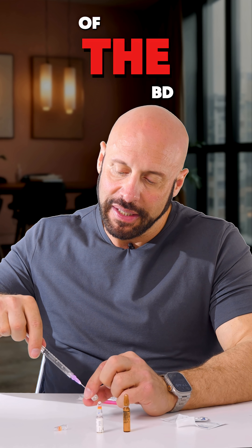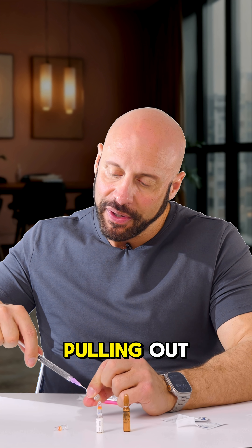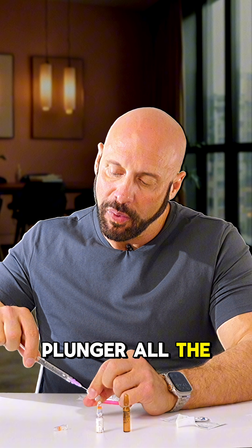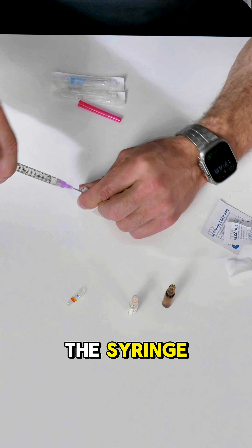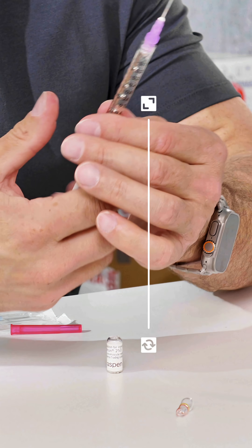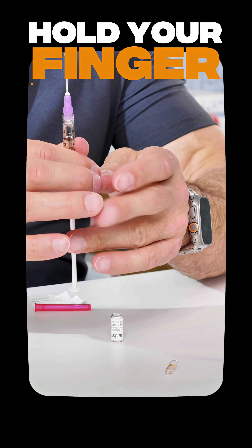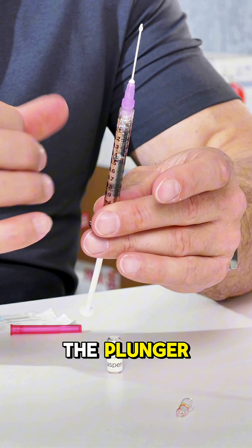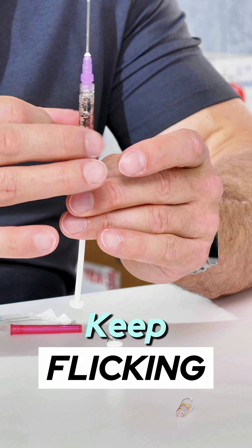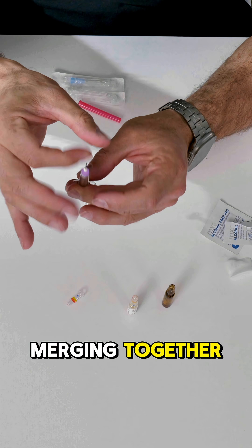One thing to note with some of the BD 1ml syringes: there is no stopper. It means if you keep pulling out, you'll pull the plunger all the way out of the body of the syringe — you don't want to do that. Now I've got lots of bubbles, and those are annoying, but if you hold your finger so the plunger doesn't come out and then just flick, you'll see that most of those bubbles are merging together.